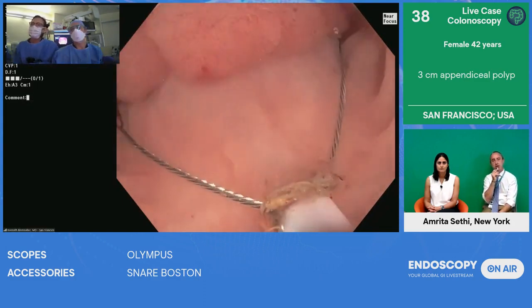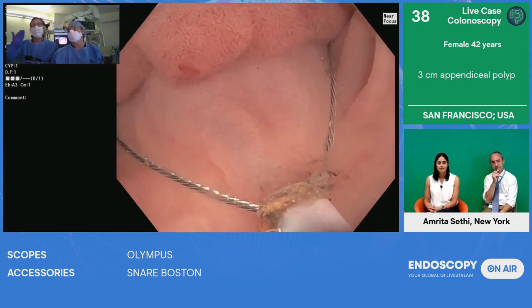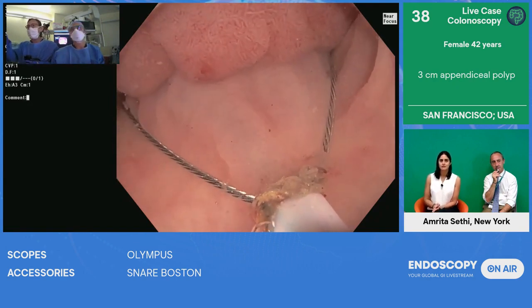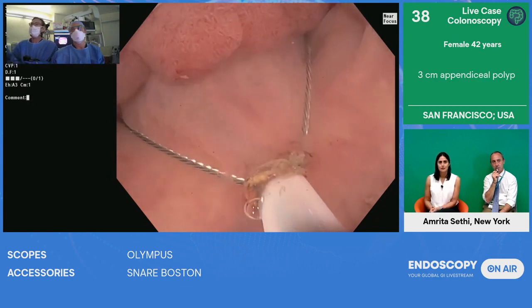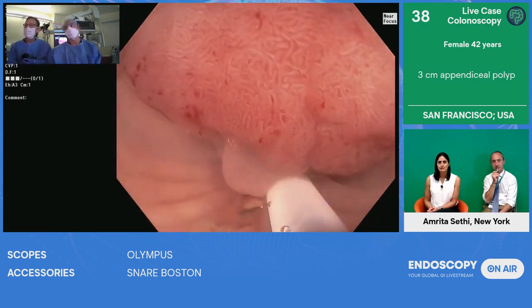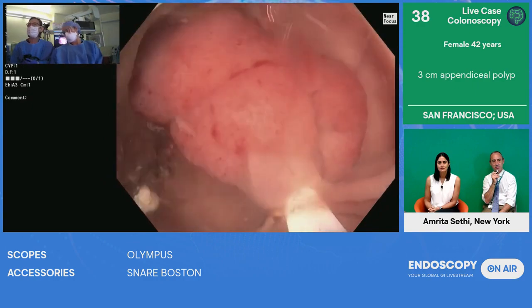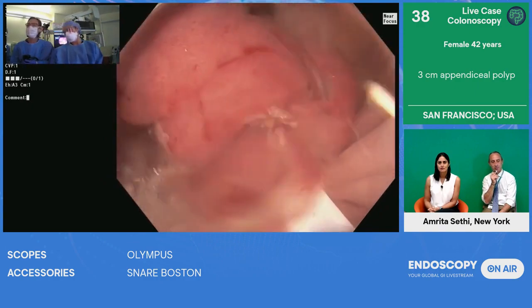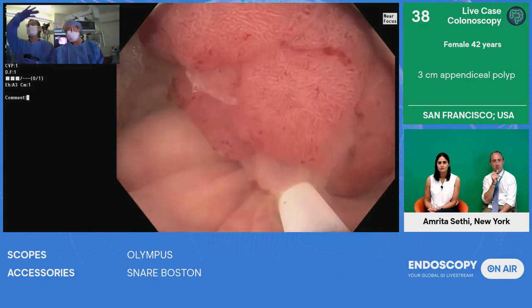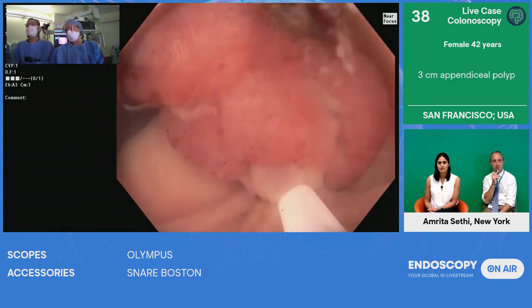All right. So and we don't need any injection, no? The suction is, with water suction, a very gentle, gradual suction, in contrast to gas where it just reds out on you, right? So slowly close, please. Okay. And once it's closed, I give it the water to look and pull it away and see if I got the whole lesion. And you see it tent away very nicely. And you don't have to worry. You're not going to capture the muscularis propria because it stays round on the outside. It doesn't follow the involutions of the mucosa and submucosa.